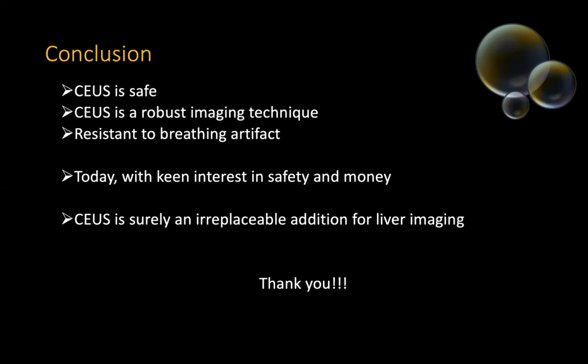And of course, before we leave ultrasound, we can't ever forget that ultrasound is always a very safe technique. CEUS is a robust imaging technique, which is resistant also to breathing artifact. And today, with such keen interest in safety and money, I believe that CEUS is surely an irreplaceable addition for liver imaging.